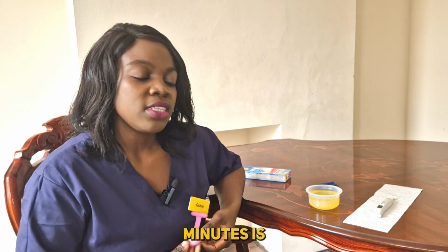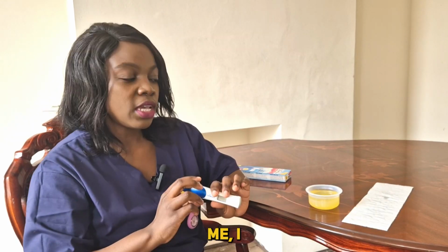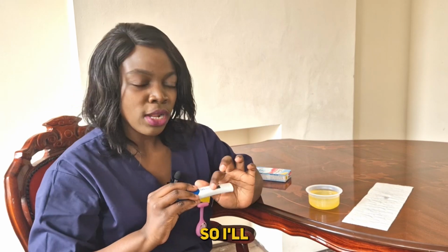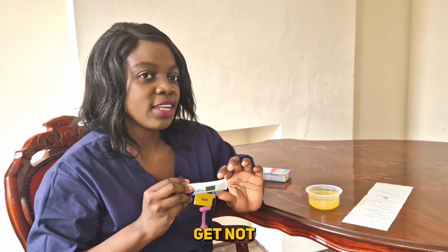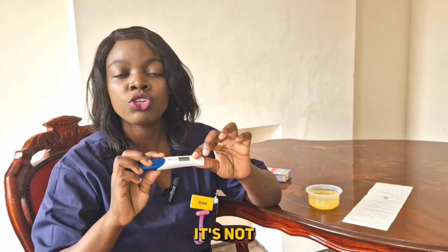So after the 5 minutes are done, I'll look at my test strip and see how the results are. I told you that I'm not using any urine, so I'll not be getting anything. Definitely I'd get not pregnant, but this strip doesn't show it. If it's pregnant, it's going to read here pregnant. And if it's not pregnant, it's going to read here not pregnant.